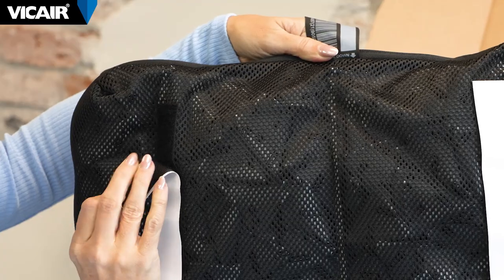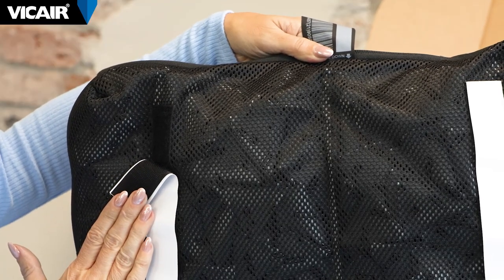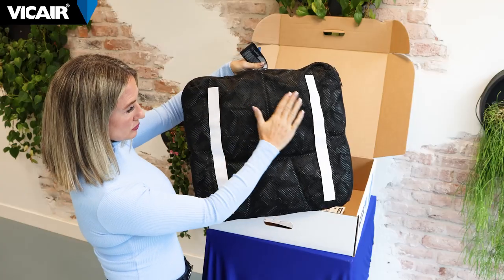The cushion is delivered with double-sided velcro, allowing you to securely attach it to your wheelchair. The back of the cushion is always indicated by the blue hanging loop, which is also used to hang your cushion to dry after washing it.